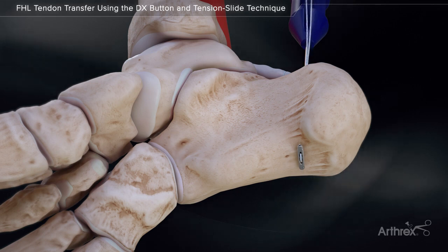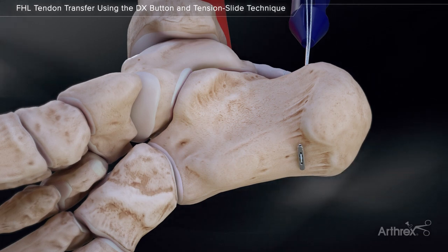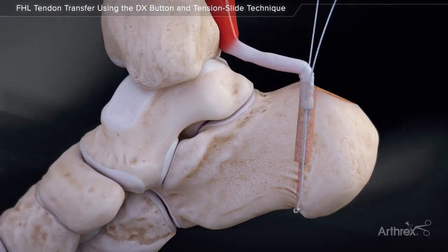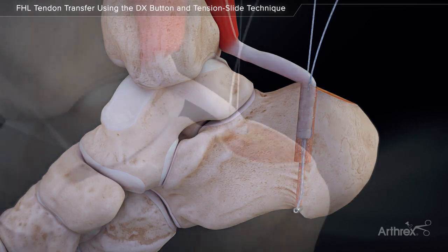Pull on the free ends to seat the button against the plantar calcaneal cortex. Confirm with fluoroscopy that the button is in appropriate position, resting against cortical bone. Remove the button inserter. Grasp each suture limb and slowly apply axial tension to dock the tendon into the bone tunnel.